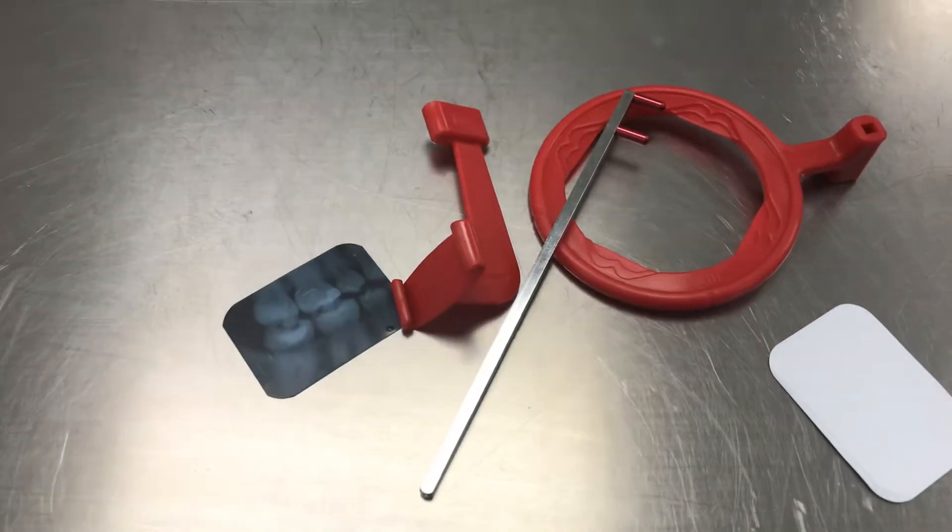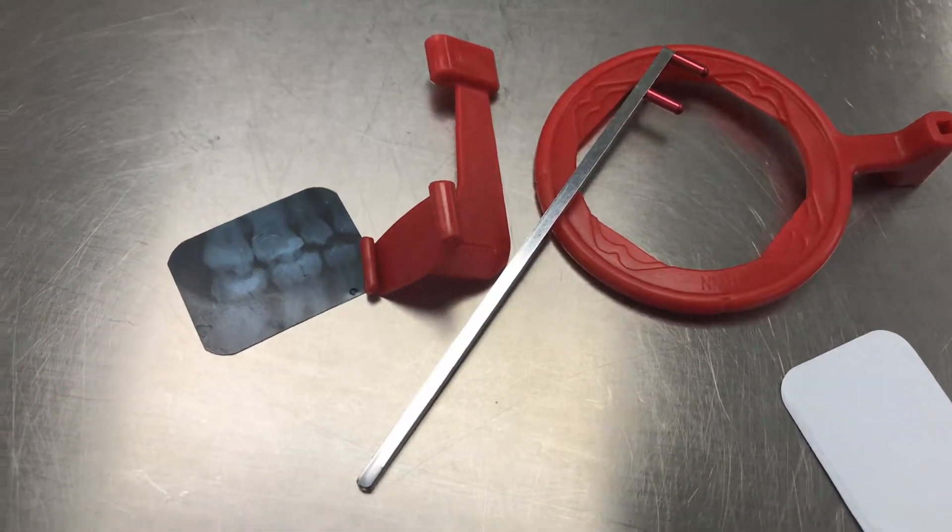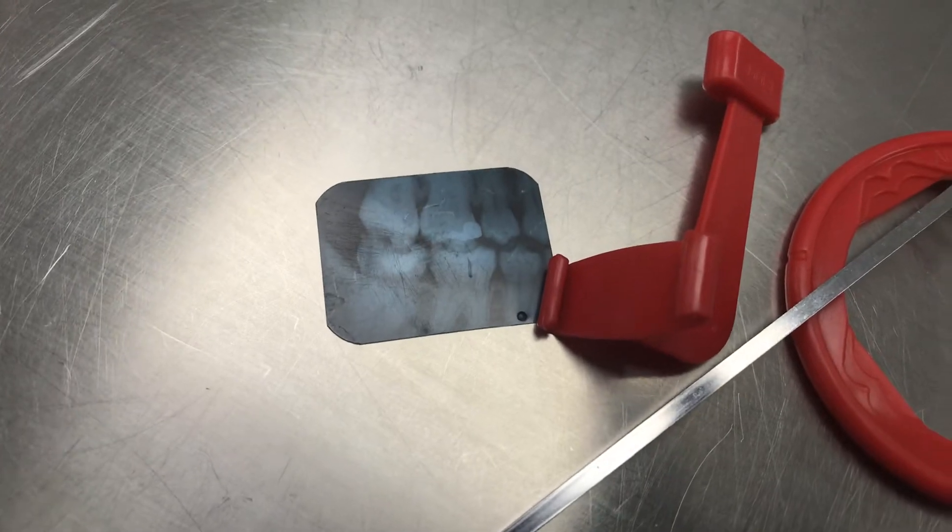Here we have the red. It is for bite wings. And here's a bite wing x-ray for you to see.